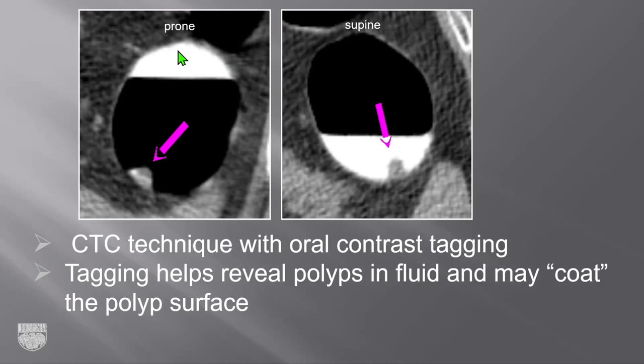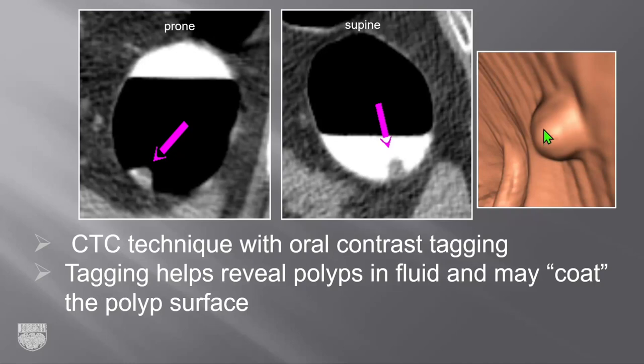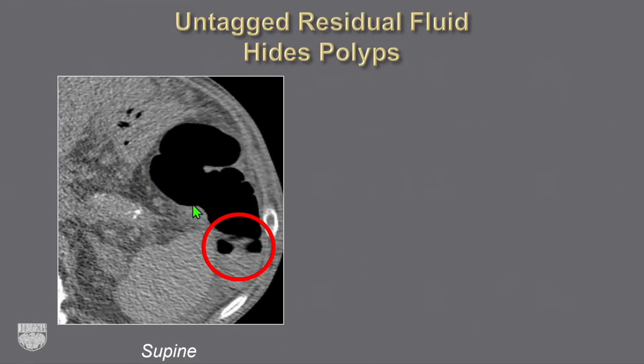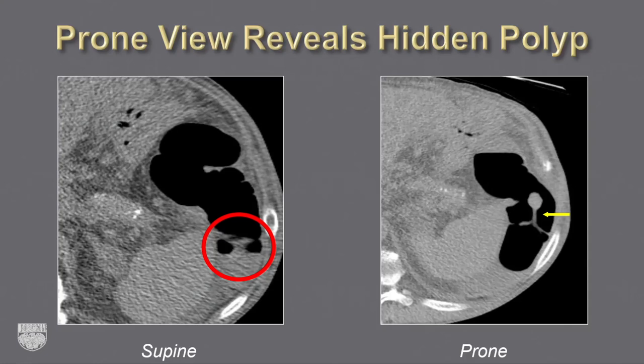Here's an example of supine and prone scans with fluid that is tagged — there is a polyp. The contrast tagging allows you to see the polyp and the subtraction software shows it well in 3D. Tagging on the polyp surface also helps detect lesions. With untagged fluid, a fairly large lesion is completely hidden on the supine view; the 3D view doesn't help. On the prone view, the pedunculated polyp becomes visible because it's no longer hidden by untagged fluid.